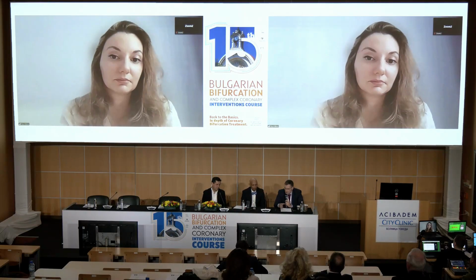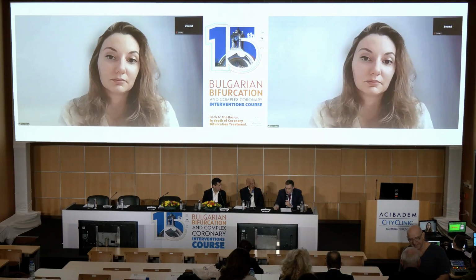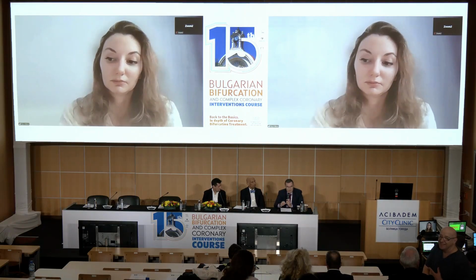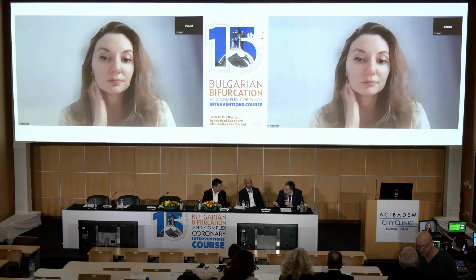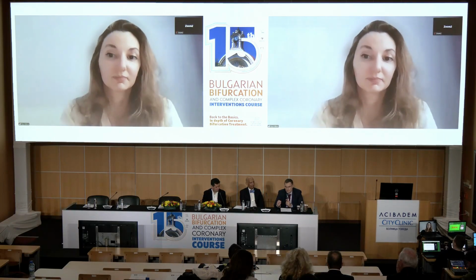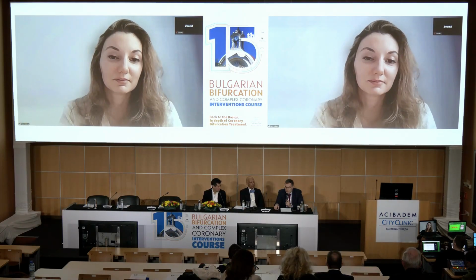And for this young patient, I'm returning back because that was a case which we made a few weeks ago. It was really an emergency case, and the patient had 13 shocks because at any moment when we passed with the balloon or something through this distal bifurcation of the left main, he fibrillated immediately after the passing of the devices, but finally we succeeded.